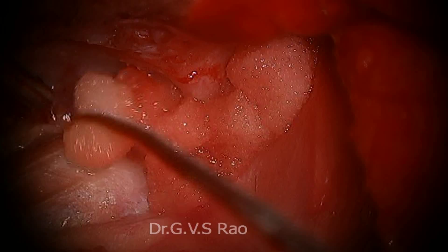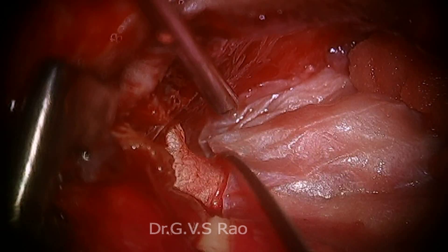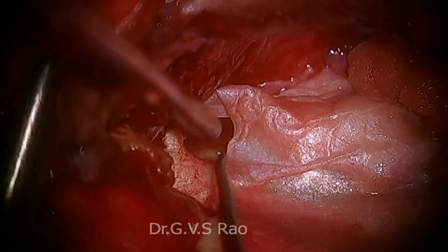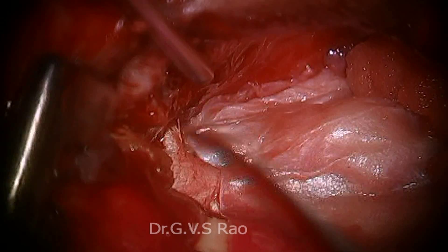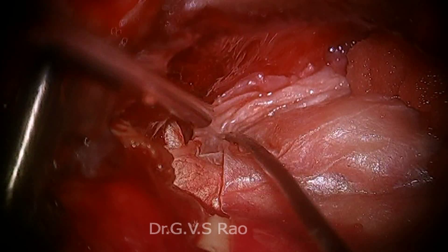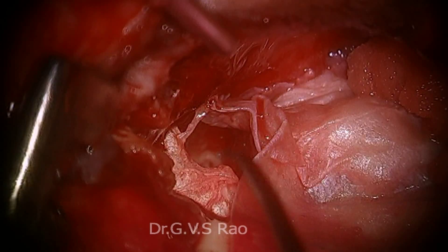Now see — it's stabilized. Now my concentration should come here. I think this is the fascia. Now with the grafted sheath — new sheath formed — and there is a little folded temporalis fascia. I can take the advantage of this folded temporalis fascia to fold it back normally and cover it. See — take the cover. I thought the temporalis fascia was shorter than required, but really lucky. See — fold it back.